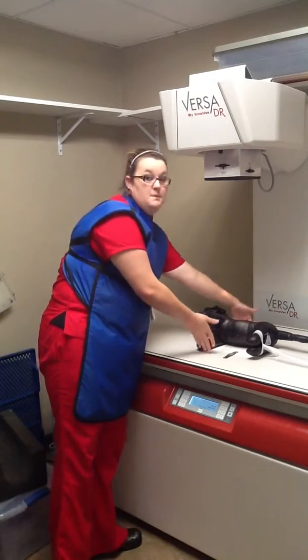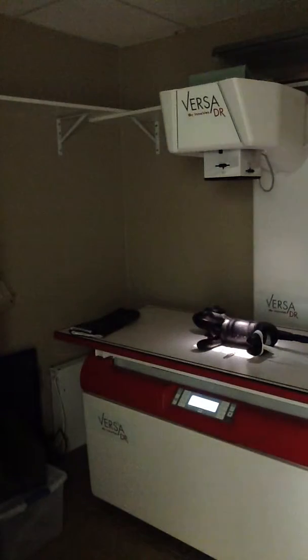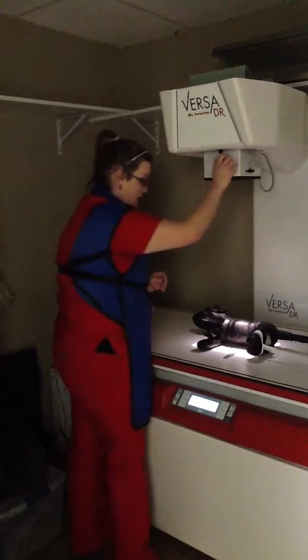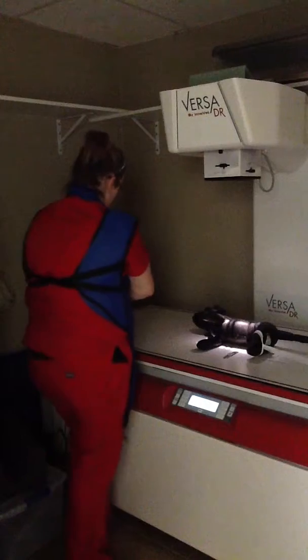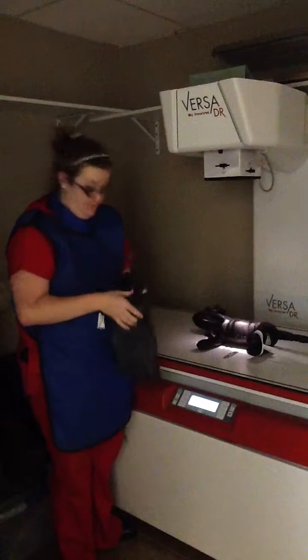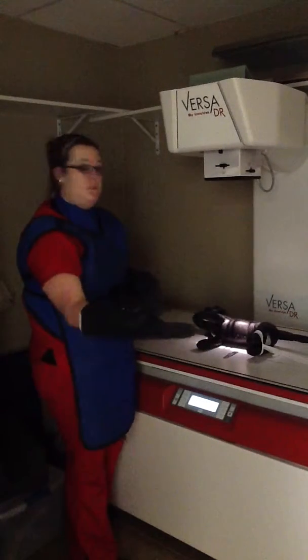With this, I don't need this much for the x-ray. So I wanted to show you. You would do the appropriate size of the animal's abdomen. Square it down. And of course you would have on your lead gloves, and the door shut before taking this x-ray. And my other assistant or person was holding for me.